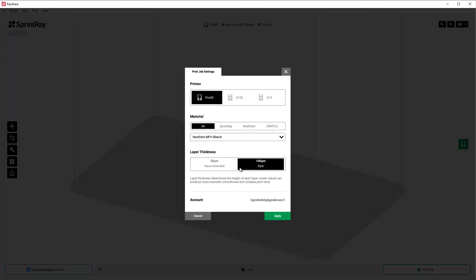50 microns will be perfectly fine, but it shouldn't really matter because we're going to end up polishing these afterwards. We want them as smooth as possible for that soft tissue healing. I'm going to click apply and now I'm going to select some healers.